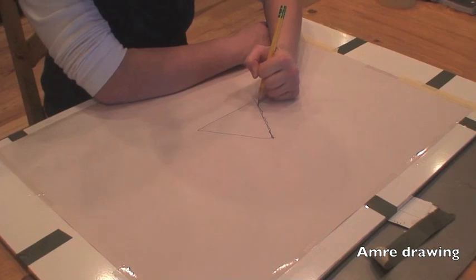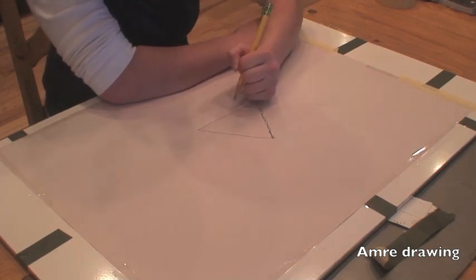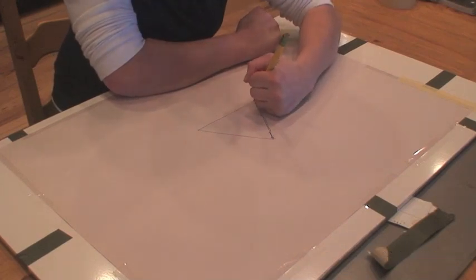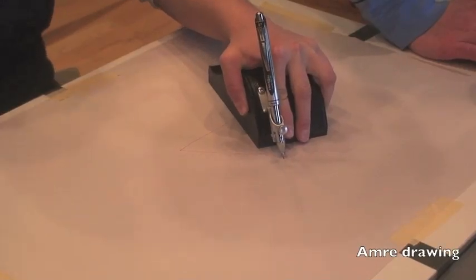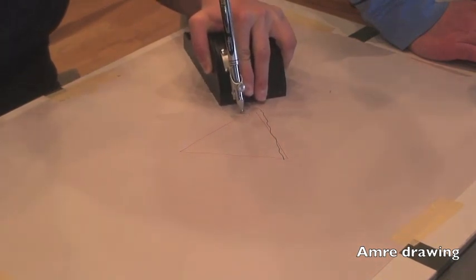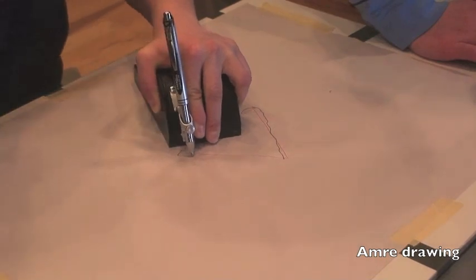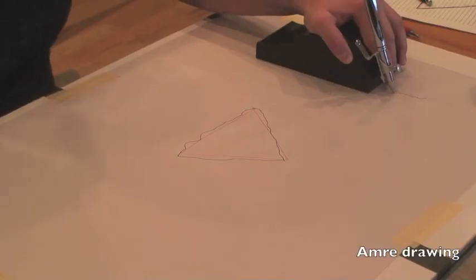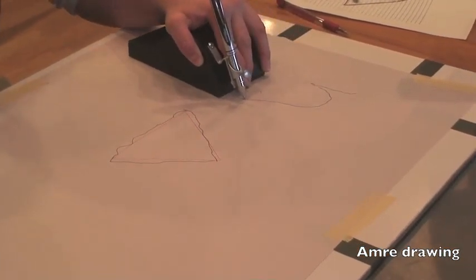This video shows Amory drawing a triangle freehand. The jaggedness of her lines is what we try to fix with the MagRite. The jagged lines are especially noticeable in this still image of Amory's drawing. When Amory draws with the MagRite, her shaking is subdued, her lines become much smoother, and she is able to draw a simple triangle much more quickly. Here is a still image of that same drawing — this image shows just how much smoother the lines are.